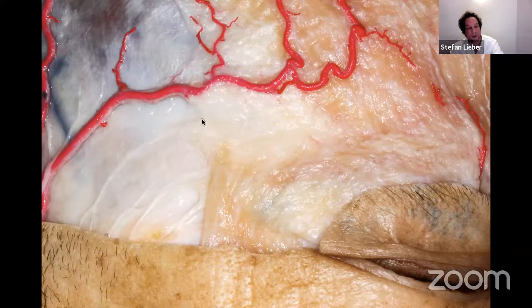fat pad. This is the beginning of the fat pad on this side, where I dissected some of the facial fibers out of this fat pad. This will be seen in some of the next slides. This is very important to control, and it's necessary to keep retraction to a minimum. It's necessary to keep bipolar to a minimum, and it's important to stay on the right plane in order to separate the muscle and the skin flap for mobilization. It's important to stay at the level of the deep temporalis fascia and to keep the nerve in the fat pad with the skin, which is anterior usually.